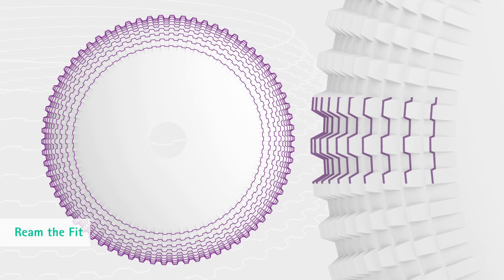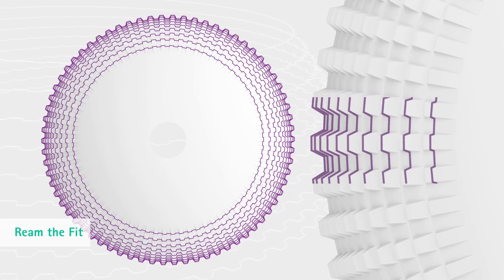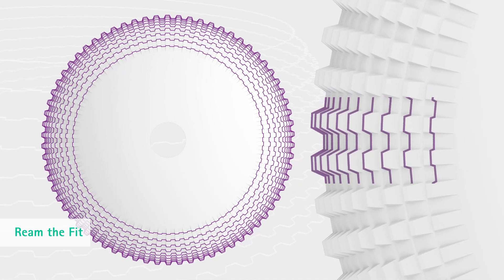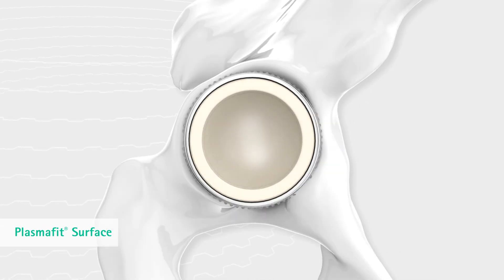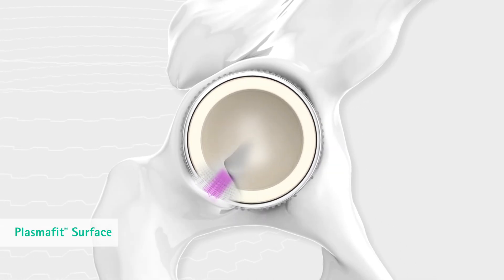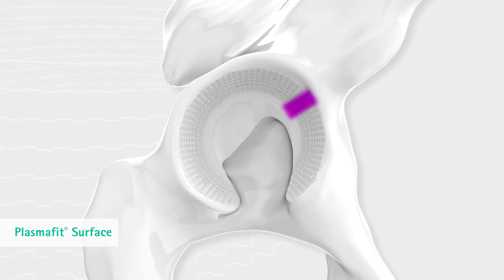The profile structure of the primary PlasmaFit cup surface features a precise and fine tooth geometry, which gradually diminishes towards the dome. The press fit locking allows primary cup stability under different bone qualities and cup preparations. The equatorial press fit is 1.5 mm.